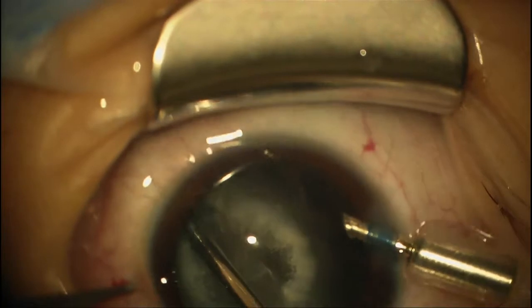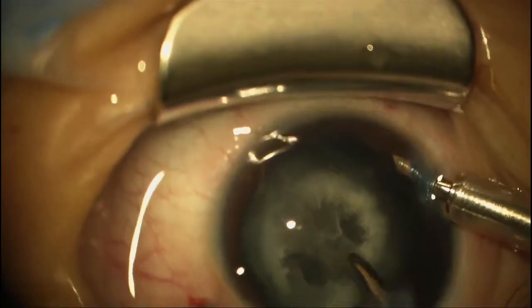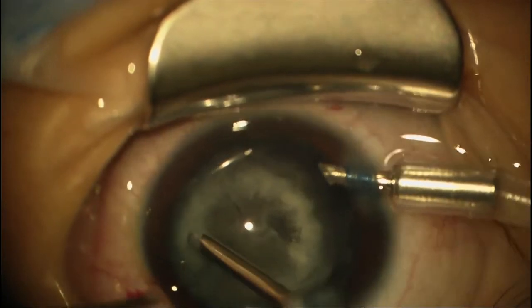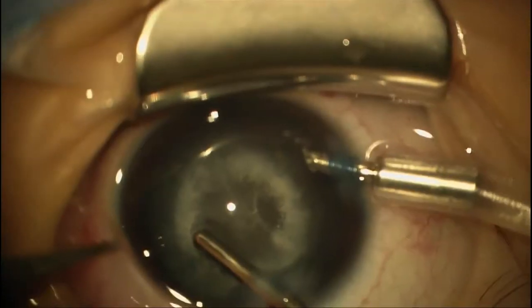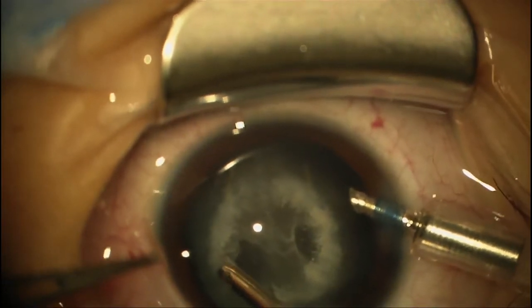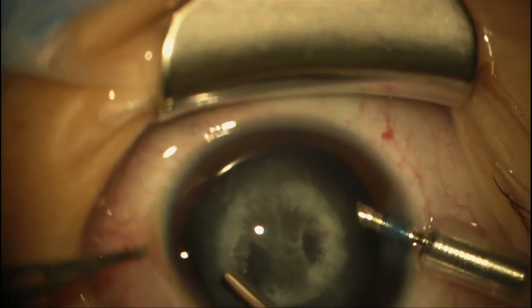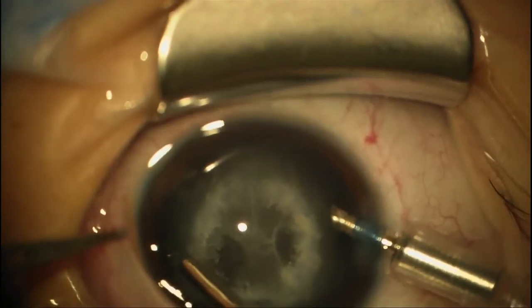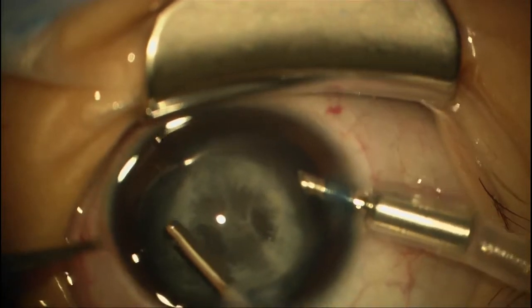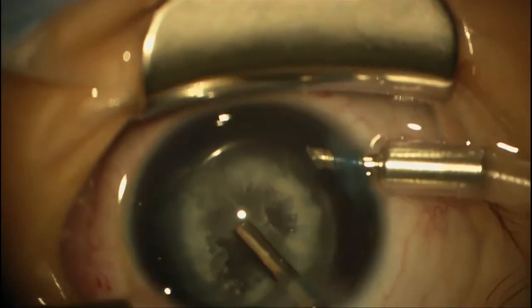We're turning the cutter off now and going to aspiration. We've got a little bit of a radial extension here, so I've turned the cutter back on to round this out. We want to try and stay away from that area as much as possible, then take the cutter off.